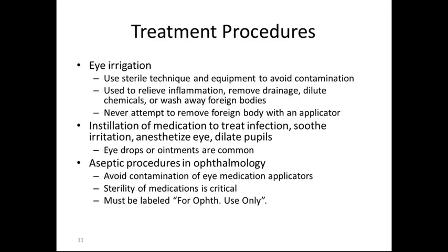Instillation of medication to treat infection, soothe irritation, and anesthetize the eyes or dilate pupils. Eye drops or ointments are common, and it is important to not touch the actual eye with the applicator. This can cause contamination of the eye.